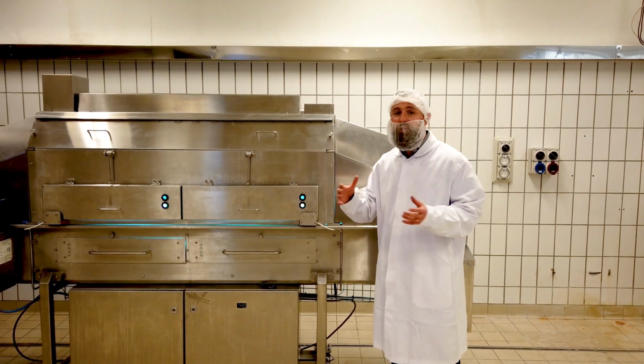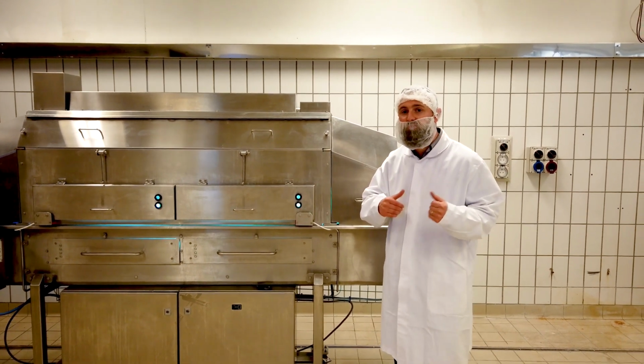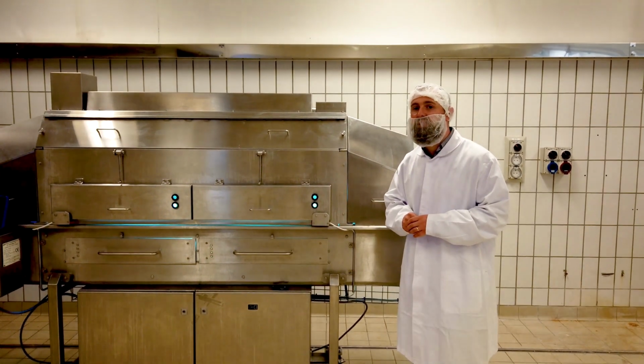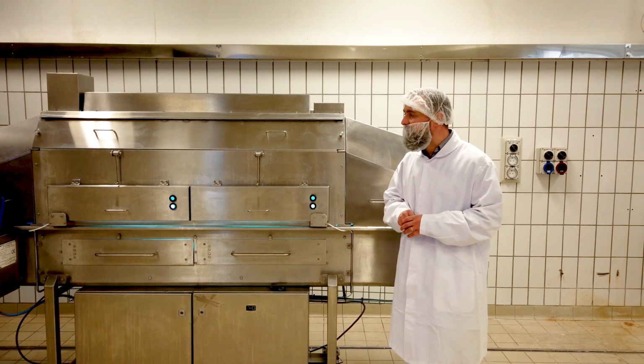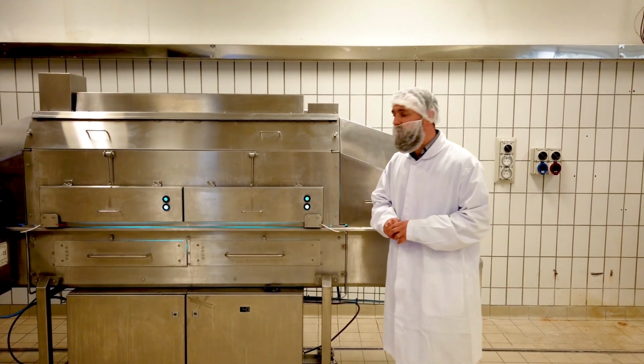People are also trying to use this for high care, low care transfer tunnels where you need to get items into the factory and you don't want to start spraying and misting it with chemicals. It's a very versatile technology that people use for surface decontamination applications.